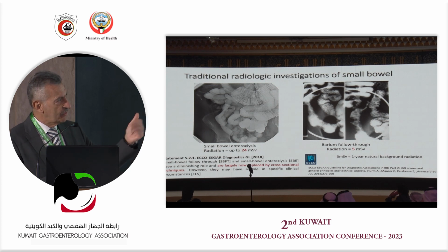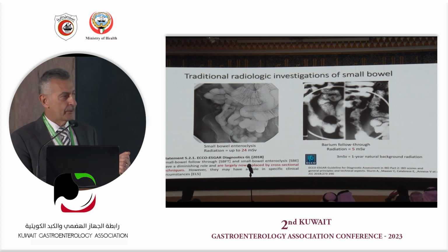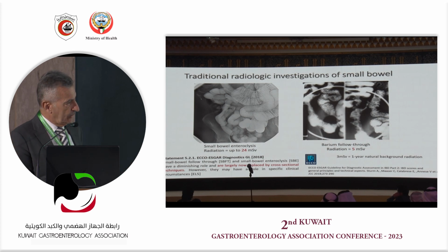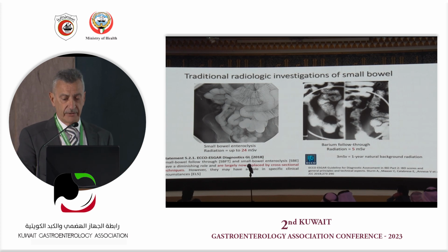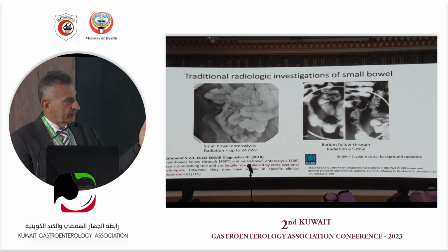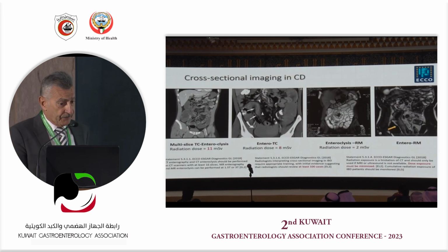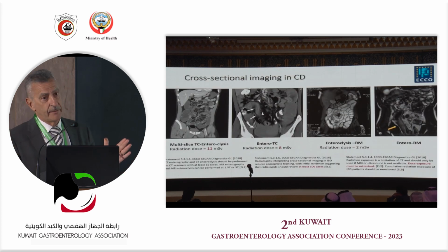So we have great imaging with small bowel enteroclysis, but we get 24 millisievert. So 3 millisievert is the exposure of 1 year. And so look how frequently these patients should have investigations during their life, and be very careful about the accumulation of radiation exposure. Less from the barium follow-through, but there the accuracy that you can get is very limited. So if you go to cross-sectional imaging, even there, pay attention to the radiation exposure.